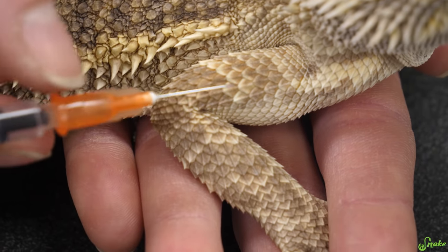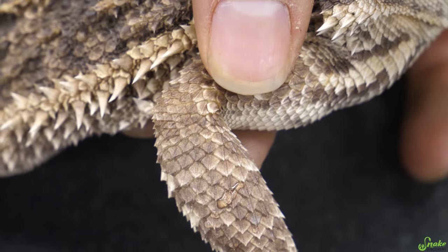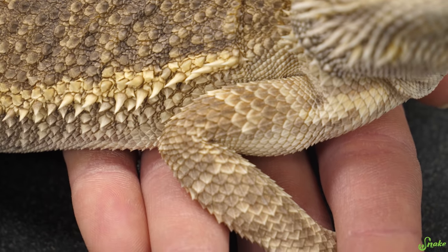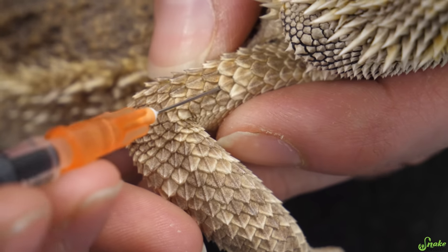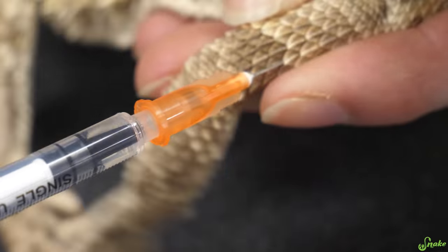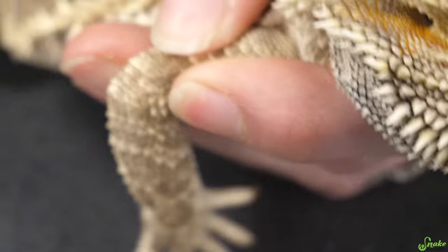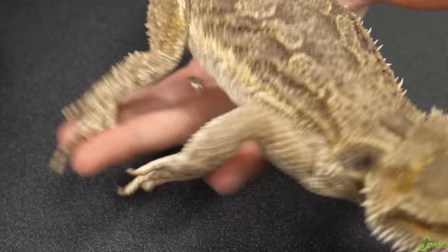Once you have a good spot and you push in the medication, put your thumb or a finger over the needle as you slide it out, and then apply a little bit of pressure over the injection site just to make sure that medication doesn't come out — help seal it up for a few seconds. So we're going to go into his right bicep today, insert the needle in between two scales, go about halfway down into that muscle, pull back on the plunger slightly — no bubbles, no blood. Then we push in the medication, put our finger over it as we pull the needle out, and apply pressure for a couple of seconds. And we're done!